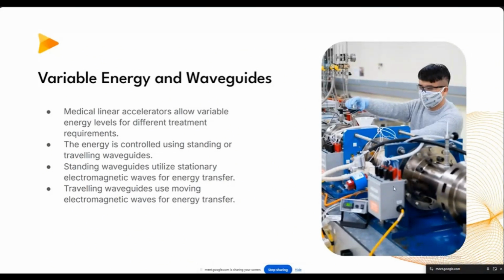In physics, there is another example called standing waves. If you have a reflector at the end and you throw a wave through it, you will get a reflection of the wave, and both these waves will interact and produce interference, and because of that interference, you will have nodes and antinodes, and that is called a standing wave. I hope all you physicists have an idea of standing waves.